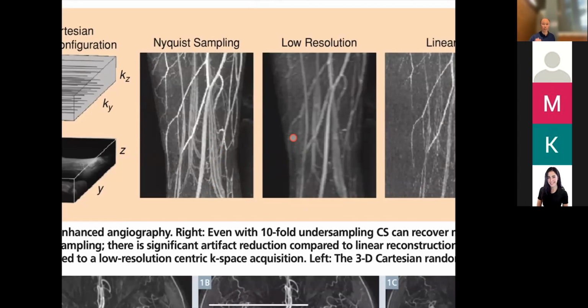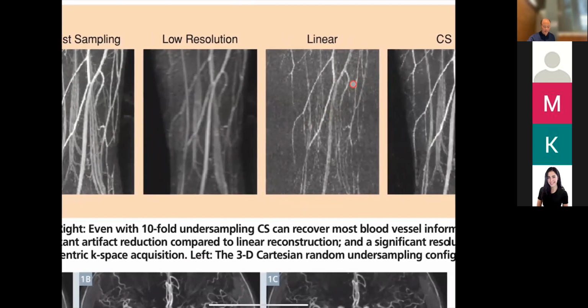Now let's just say you did your best linear reconstruction, like a minimum norm estimate. It's okay, but it's pretty noisy and you still aren't seeing a lot of the details. You still lost a lot of the details, and a lot of that's because you've amplified your noise and there's aliasing. So the idea is when we undersample every other line, we get this very structured aliasing. When we sample randomly, the aliasing becomes like adding noise. Imagine you have all these replicas, but they're added at random places, and so it appears as noise. And so that's why you're seeing this really high noise level everywhere.